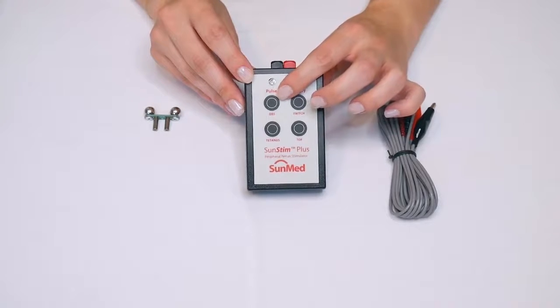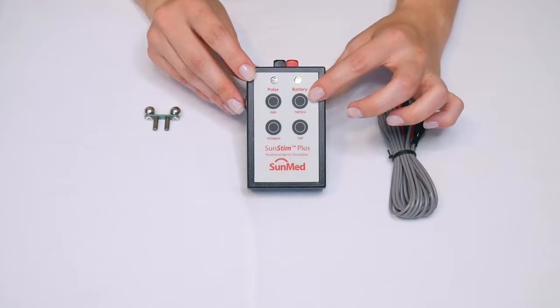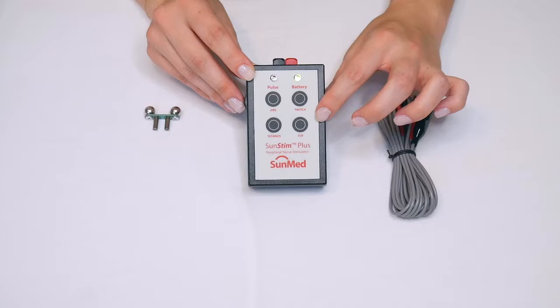Twitch mode produces twitch stimulation when pressed and held down, which is automatically repeated one pulse per second. You can turn it off by clicking the double burst or TOF button.